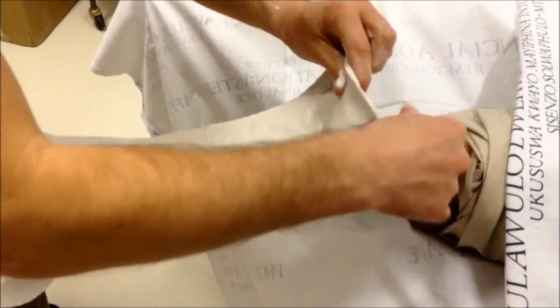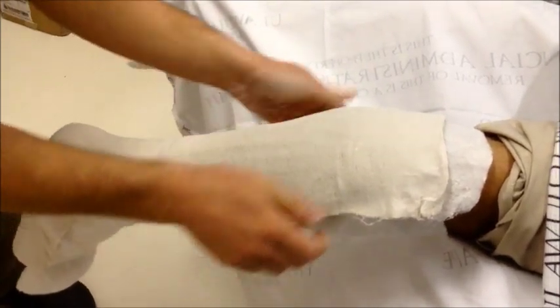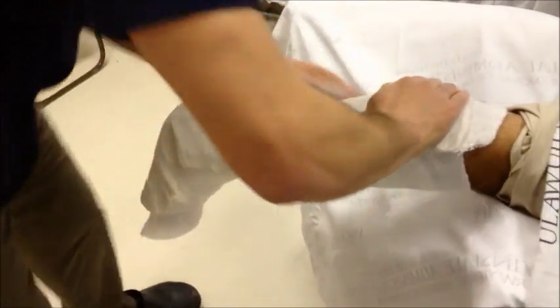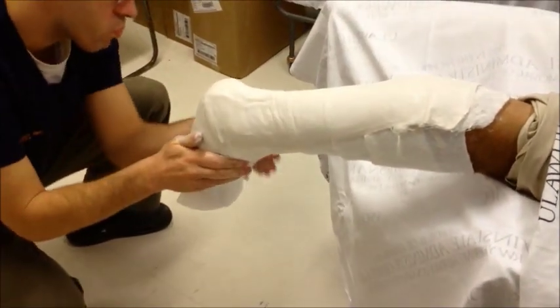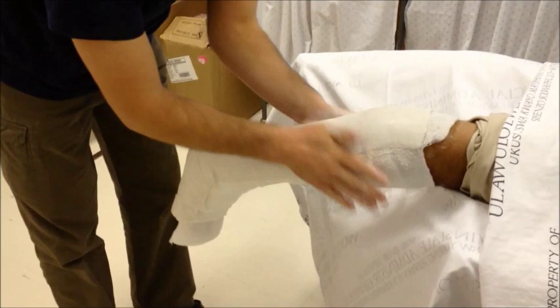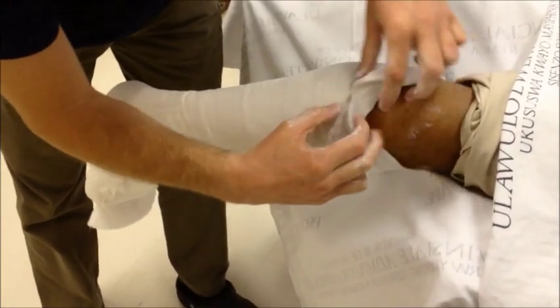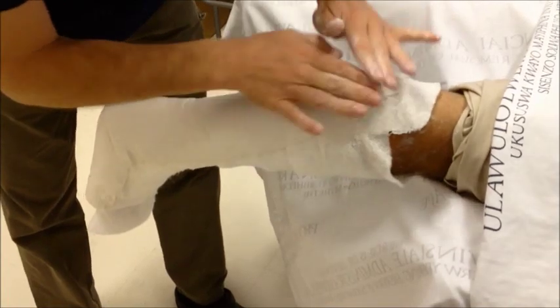From the top, make sure it's laid down nice and square on the leg. You want to make sure it's nice and tight around exactly where it needs to be. Laminate to make sure all the fabric landmarks are out. As always when handling plaster, never use fingers and thumbs because you'll create pressure points — always use the flats of your palms and fingers. The second landmark apart from the little toe that we don't want to entrap is right at the head of the fibula where the peroneal nerve curves around. So if you're going up quite high here, fold back that little edge.